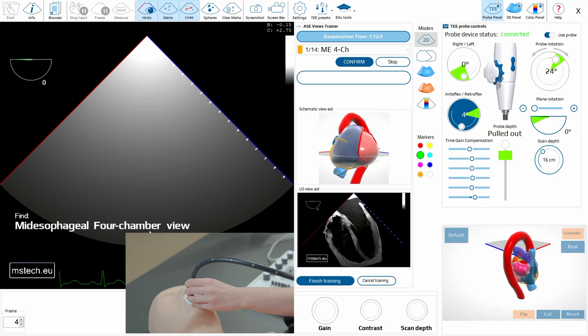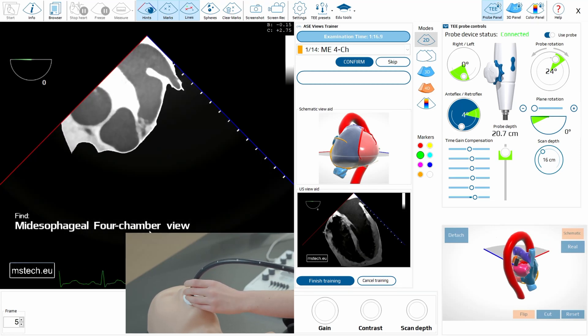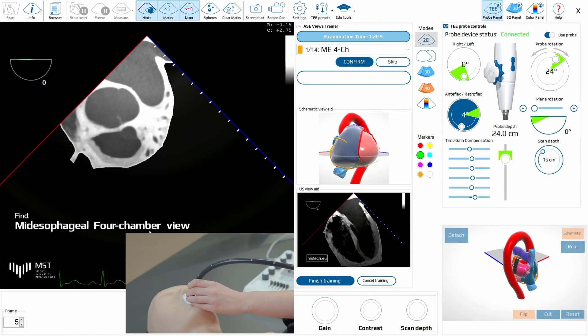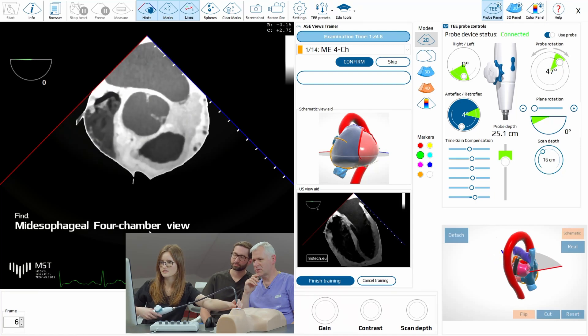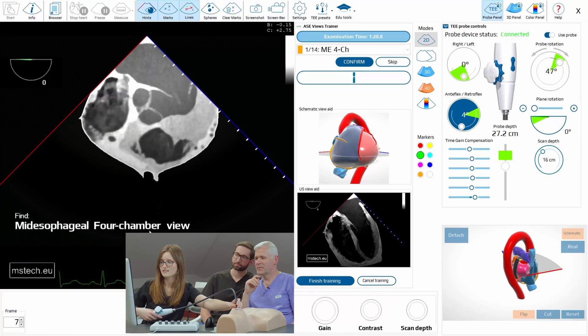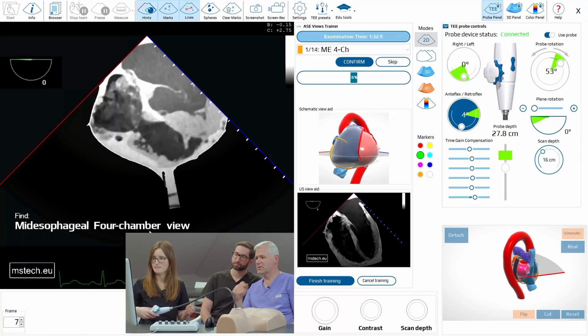Go, go, go — no problem. So you have to pass the aorta. Keep the aorta in the center more or less. Go deeper. And now you have to do this view here.